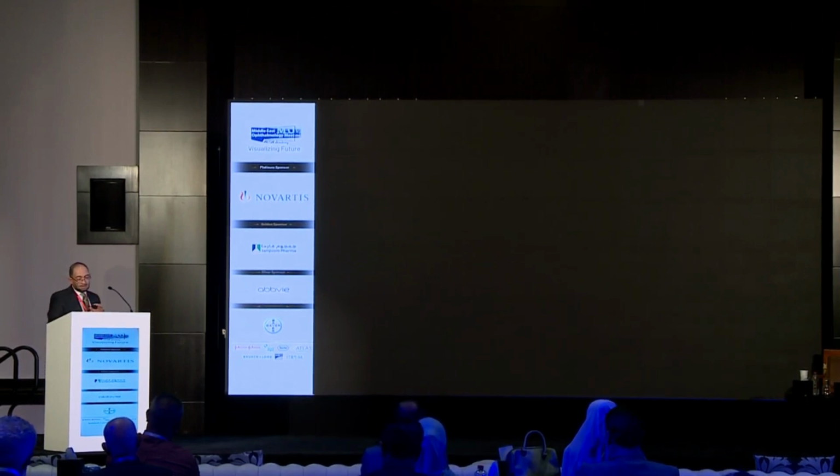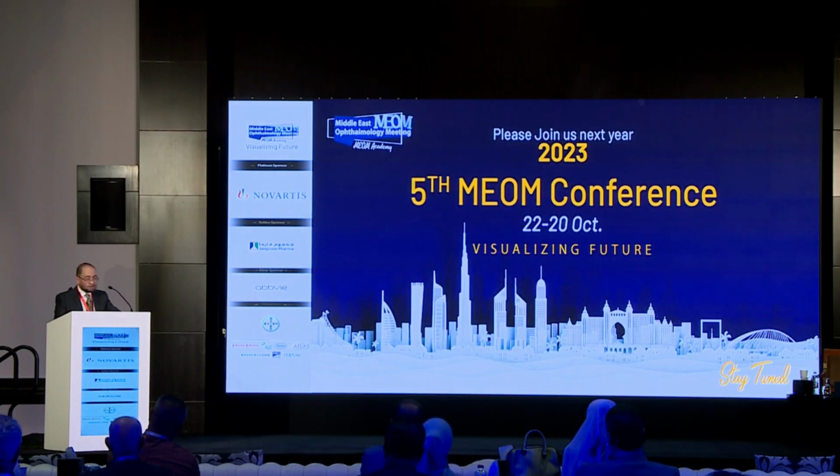In these 5 perils, I will show a new approach to go through and solve each problem. First of all, in hard cataract we need a large capsulorhexis, and we need to skip the hydrodissection in the beginning, because one of the important problems that we are facing is the hydrodissection. So I skip it in this approach.